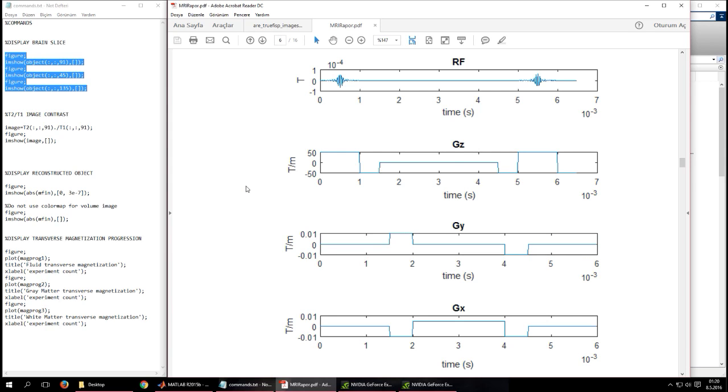The time step size of this simulation is 10 microseconds. So in one phase encoding experiment, 200 samples are collected in the readout direction. 432 phase encoding experiments are performed in total in the simulation. So we have 432 samples in the phase encoding direction.